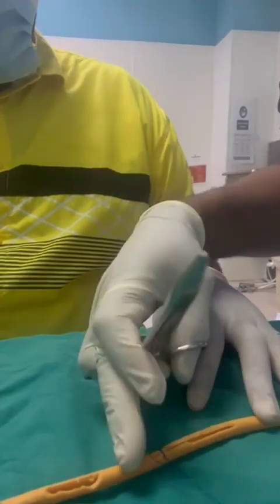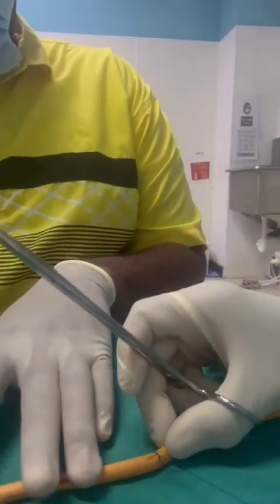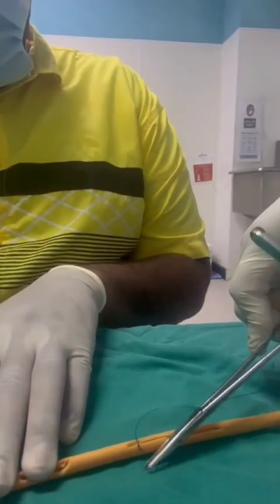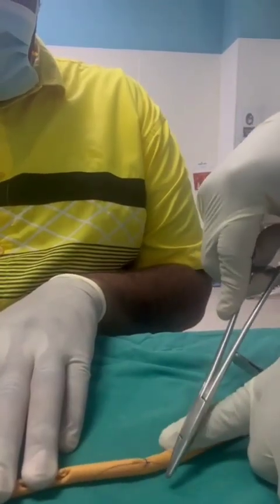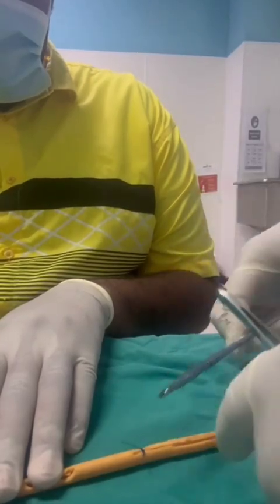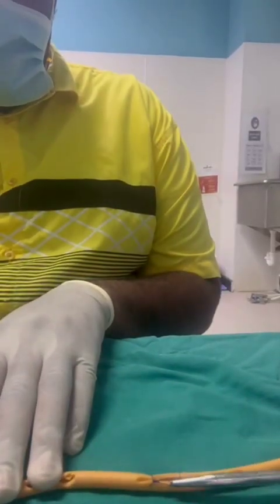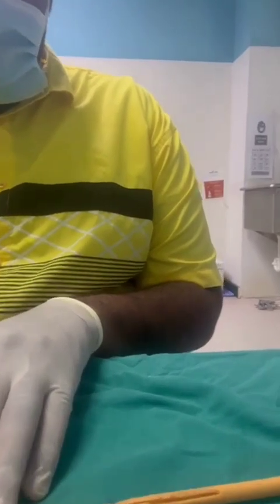I would need you to hold here for me. You can pull the knot on the opposite side. Pull the knot over to one side so that it is not over the incision. Then make a loop backwards. Make a knot forward. Again, pull the knot away from the wound. Make a loop forward so that the knot is nice and flat. And with Prolene, because it has good memory, we make a minimum of 5 to 8 throws and cut that 1 centimeter from the knot.